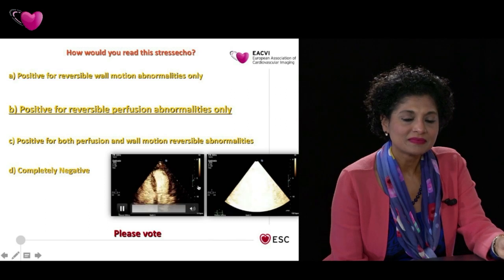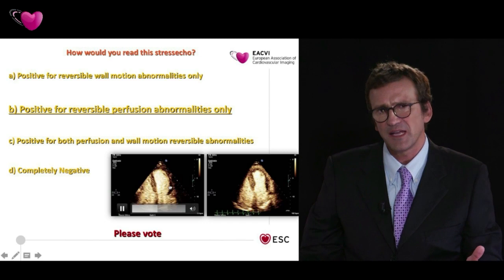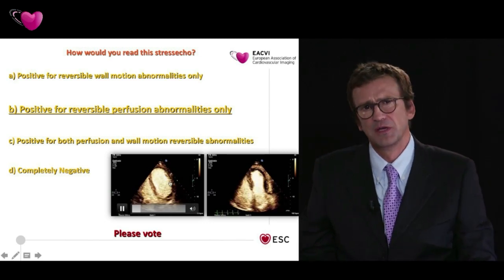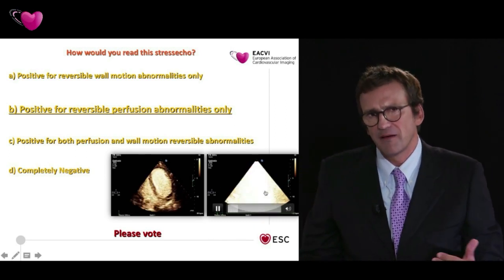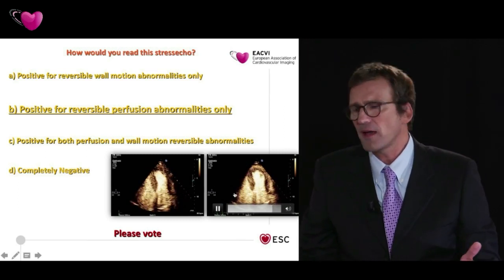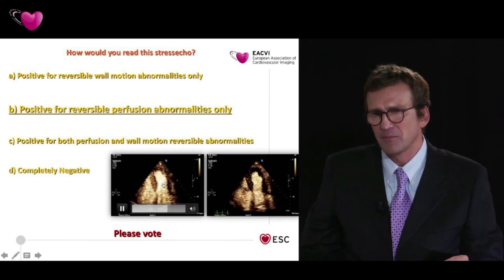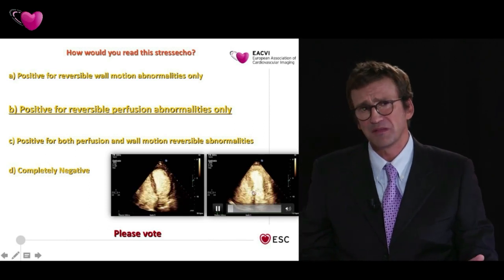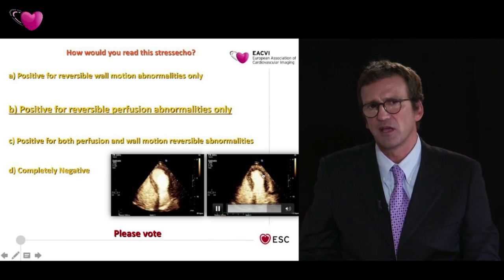Yes. The key point here is that contrast gives you such a high quality of assessing thickening and wall motion that it's actually rare that you find only really isolated perfusion defects, because when you go back and look at wall motion, you can finally find some type of wall motion defect in the region of the perfusion defect. But just to say that this was a typical perfusion defect in the apical. Isn't it?